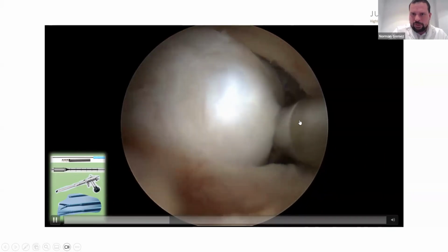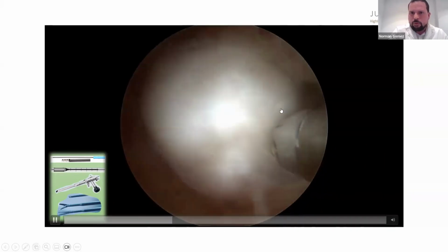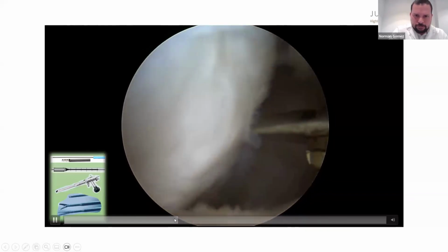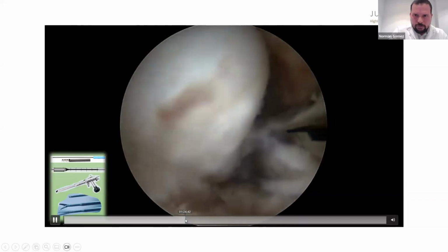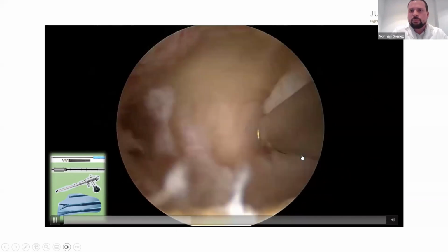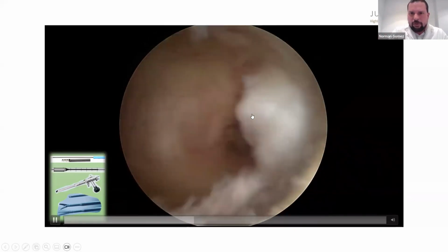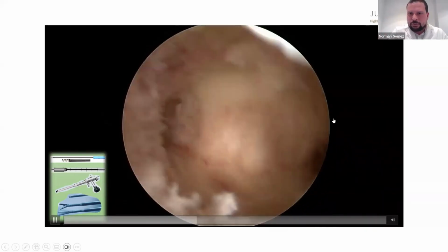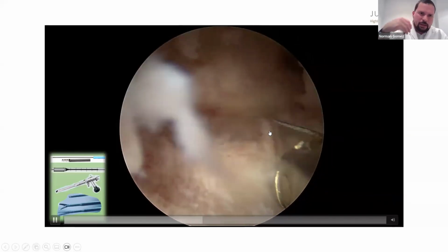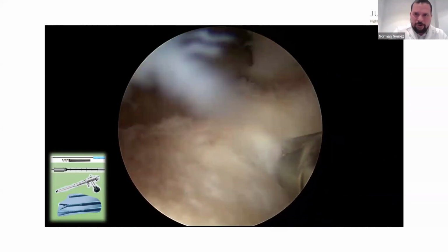We can put the scissors behind and pull inside the free part of the uterine cavity. Again, we need a space here to do the other myomectomy. So we reintroduce the fibroid in the pseudocapsula, don't waste time, and approach the other fibroid.